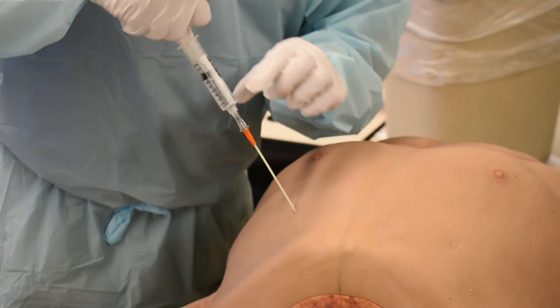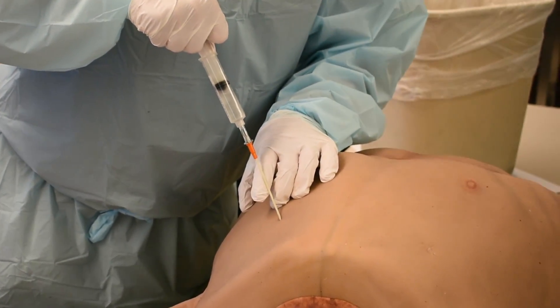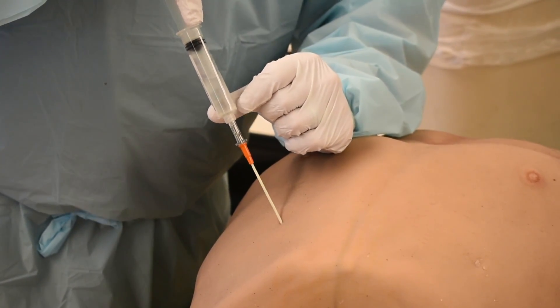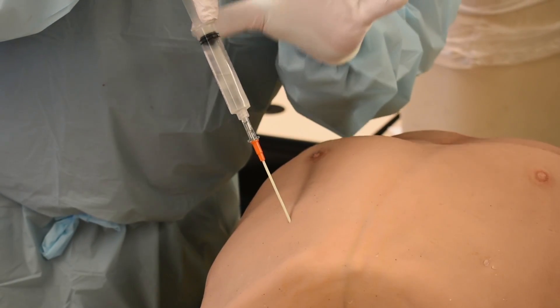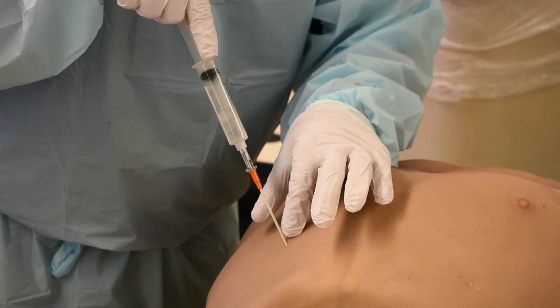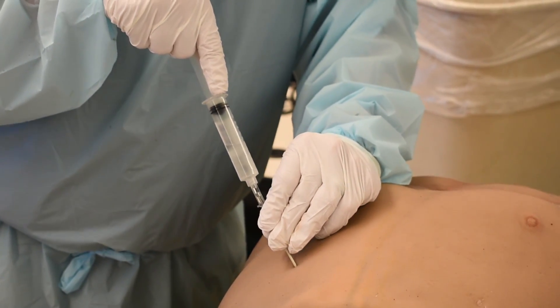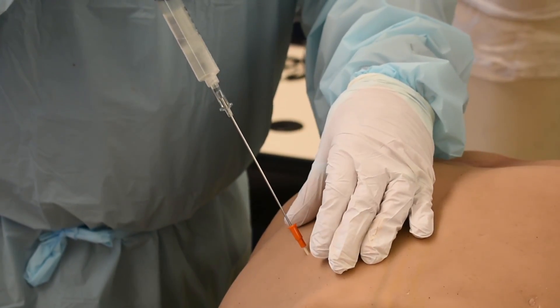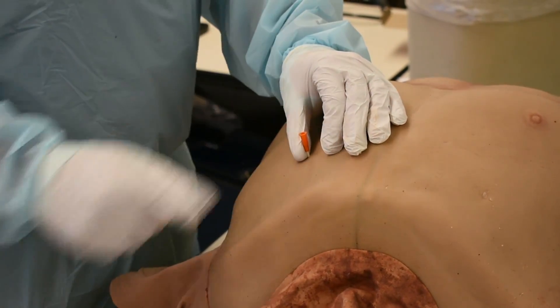As I bury my bevel, I start pulling back where I can see it — I wouldn't want the label in front because I can't see it. Now as I drive that needle through his chest, I get this huge rush of air. It may be blood-tinged — that's okay. I stop what I'm doing because I know my bevel and my catheter are through into the chest cavity where I need to be. I use this 14 gauge needle itself as a guide rod. I hold my needle where I have it and just start advancing my catheter into the patient's chest. I'm not driving my needle any farther forward. Now I can pull my needle back — it's a sharp, it goes right in your sharps container. The patient's going to start venting; you've already started venting air by getting your bubbles.